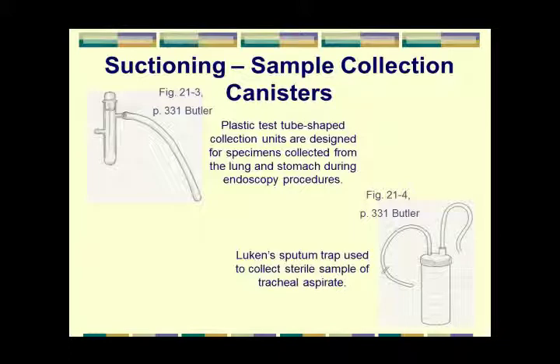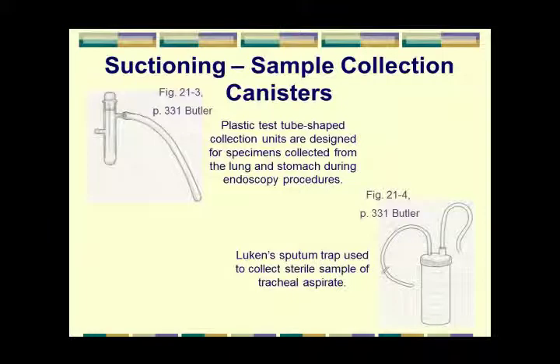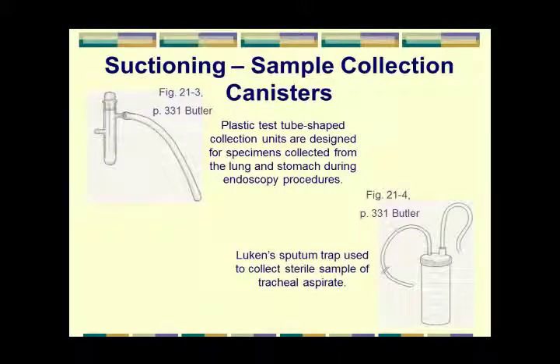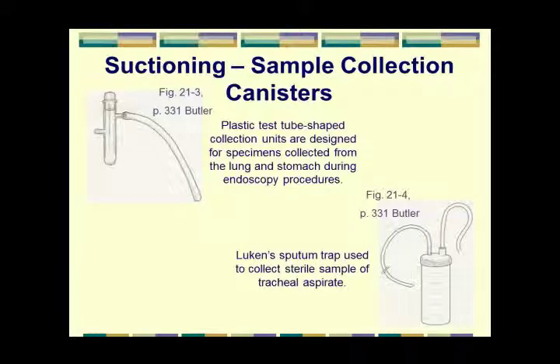We will have a situation where we'll use a Lukens sputum trap, which is a collecting chamber to get a sample. So I'm putting a patient on a mechanical ventilator. We've just intubated them. That first time we suction, we'll typically do a sputum specimen to get whatever the patient might have already been colonized with, to be able to identify it.